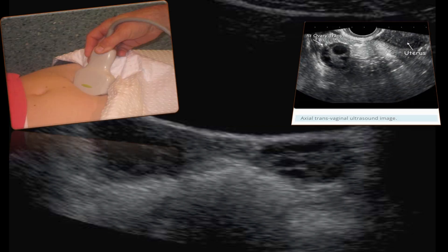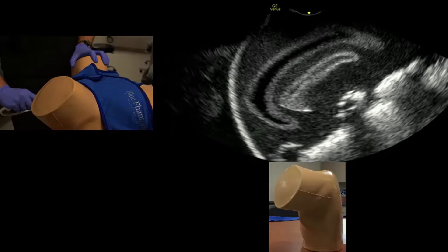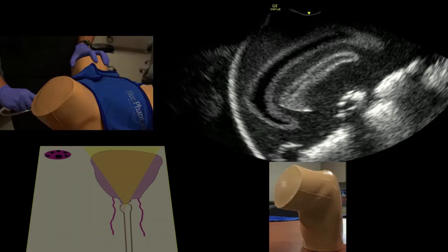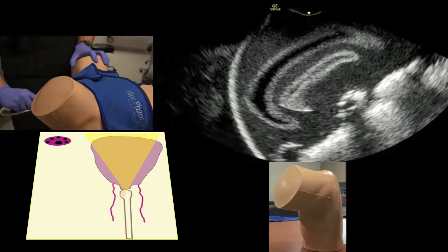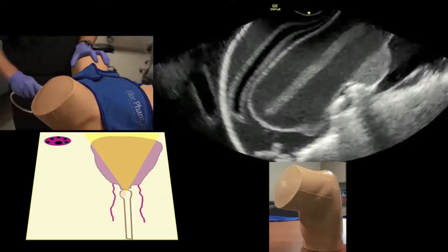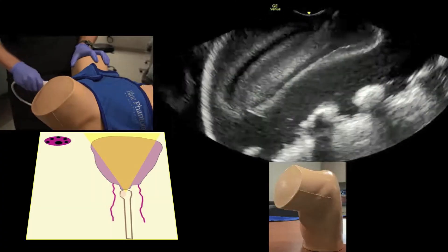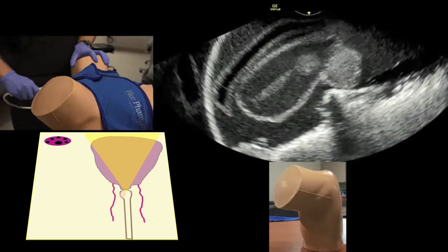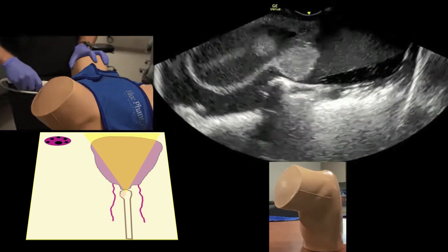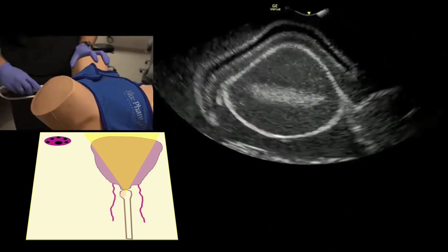On axial transabdominal ultrasound, the ovary is seen lateral to the uterus. In the case of an axial transvaginal scan, reposition the probe into the fornix to angle towards the adnexa.